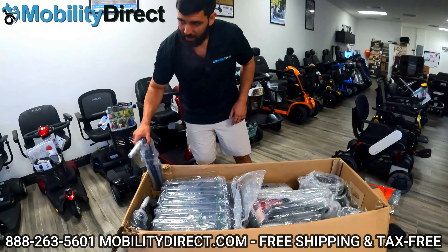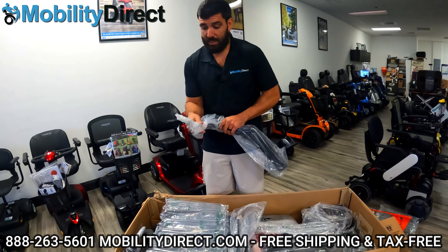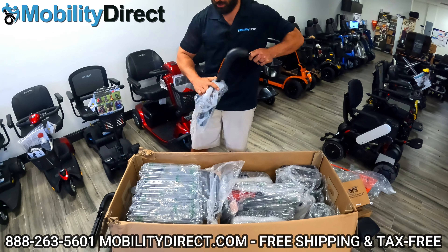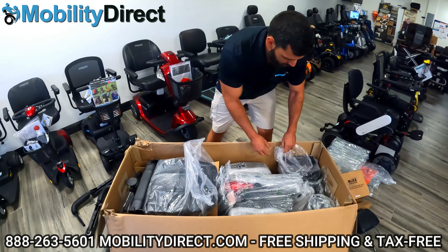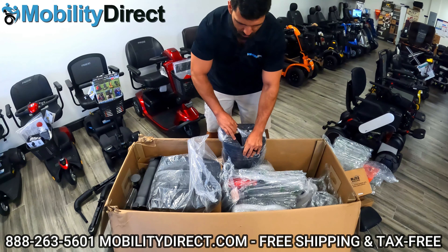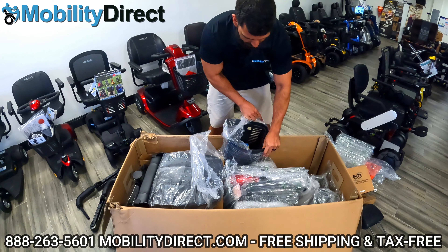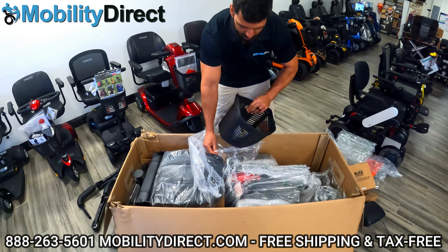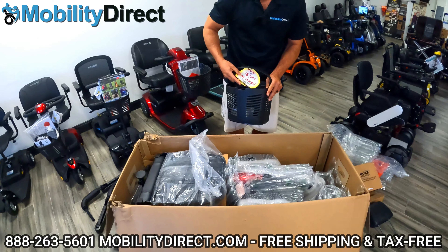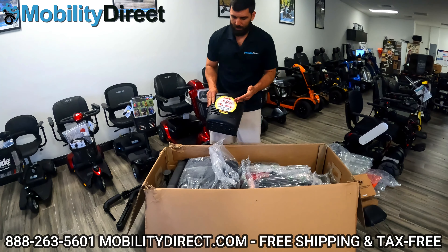Off to the right we've got your armrests, so I'm going to start taking those out. We'll just fast forward through this part. Now we're getting close to the point where we can start removing the bulkier pieces. I'm going to go ahead and remove the basket, which comes for free — it's a front storage basket that attaches to the steering column. The Buzzaround LX is the bigger version of the Buzzaround Extreme, so it has a captain seat, 18-mile range, and it comes with that basket in the front.